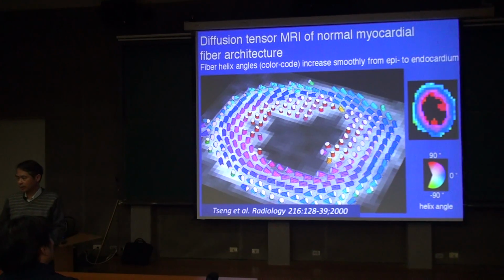And this angular orientation is very symmetric. You can see, very symmetric. I was shocked when I did this analysis. I found that the heart is so simple and beautiful, like this. Okay? So sorry, the heart is beating.